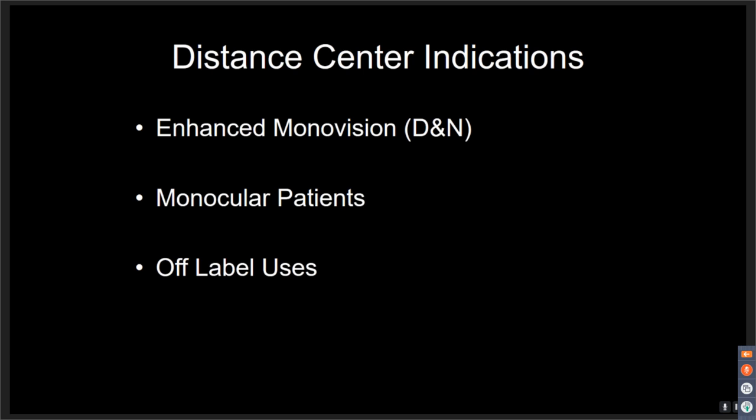So the kids really see no different with that lens than they do with any other lens. But I'll put a ring on the outside, a 1 millimeter ring all the way around, and it is a +3 or +4. I'm doing +4s now. I did +3s for a while. Seemingly, anecdotally, we seem to have had success with this, so it certainly is an exciting thing to think about. The worst case scenario is the kid just keeps increasing like they did before, and you really didn't help them.